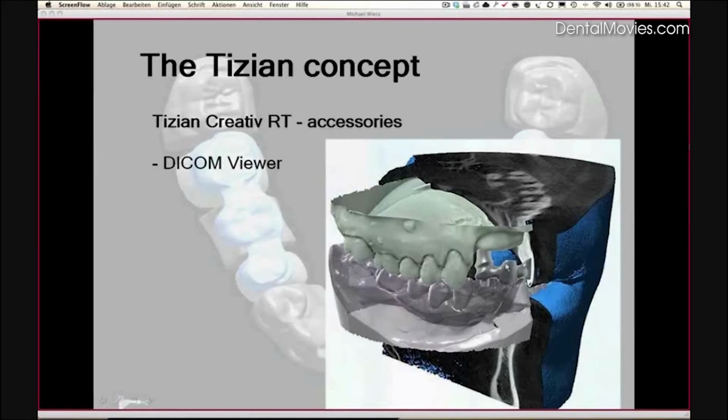and we prepare a little bridge here in that incisor area, so we can orientate the pontic or the bridge posts here according to the situation of the remaining teeth. That helps the technician tremendously to design the prosthetic according to the existing static situation of the patient.